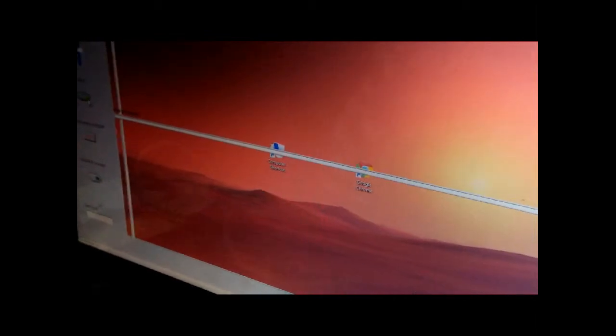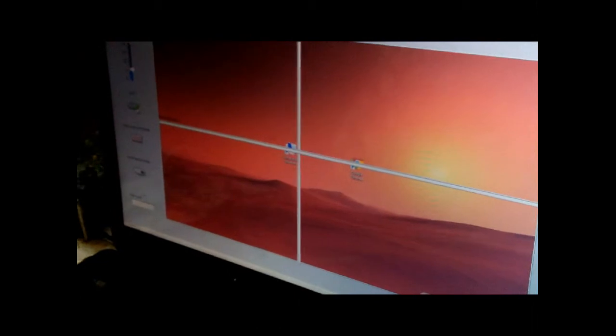Using a browser. Once the browser is selected through the crosshair selection mode, a double blink would enable the user to access the keyboard and type the keywords. Once the text is built, it is entered into the text area of the browser where it has to be copied through the same crosshair selection. The user can also store his blink sequences to increase his browsing speed, and then assign blinks.